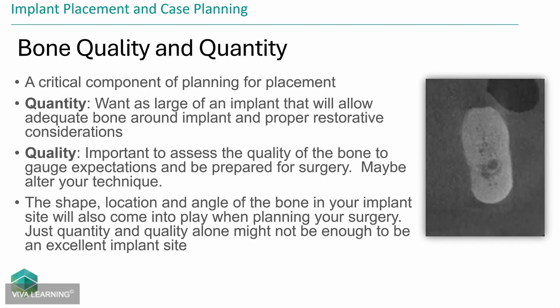Now, when it comes to quantity and quality, I would challenge everybody in here to look at this picture on the right side and say, do you like that picture? Is that an implant you'd be excited to place? Because with me, without thinking about it and really looking at it, originally I look at that cross section, I say, yes, I love that. Then this was that same patient that had the bone atrophy or the disuse atrophy. But if you look closer, that is D1 bone, and that is solid cortical bone, almost no medullary bone.